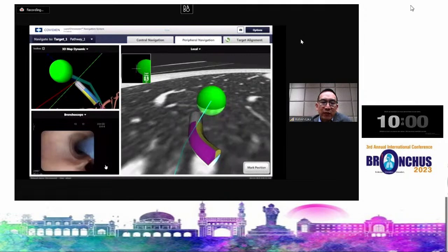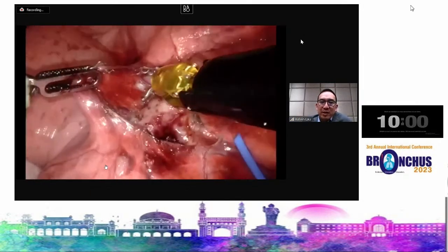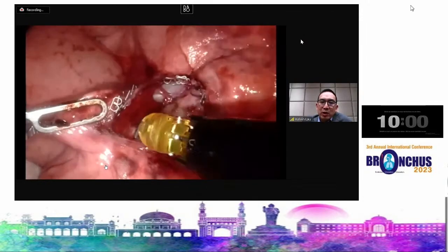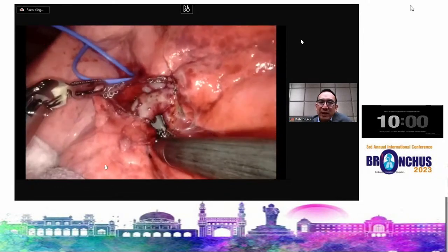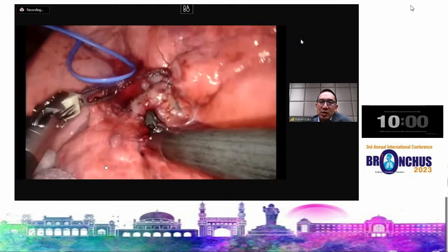And also the bronchus, they've got a common trunk of 9 and 10. So it's quite difficult. I think this is jumping quite a lot, and I'm making this quite fast. So you can see for us, I think one of the trends for robotic surgery, certainly in Europe, is it was difficult to get when it was just about lobectomy. It's difficult to convince people that there's any benefit and to go and do it.